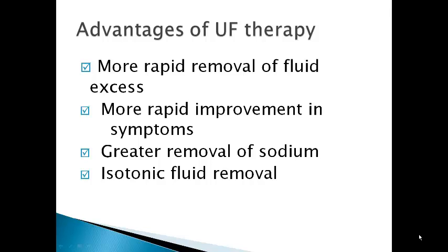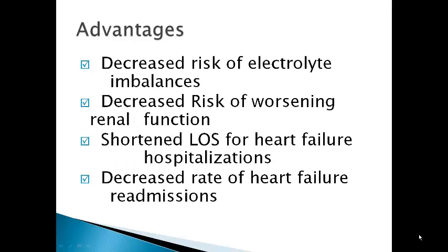Some advantages of ultrafiltration therapy include a more rapid removal of fluid excess, which leads to a more rapid improvement in symptoms due to a greater removal of sodium and a more isotonic fluid removal. Other advantages are the decreased risk of electrolyte imbalances, the decreased risk of worsening renal function, as well as the shortened length of stay for heart failure hospitalizations and the decreased rate of heart failure readmissions.